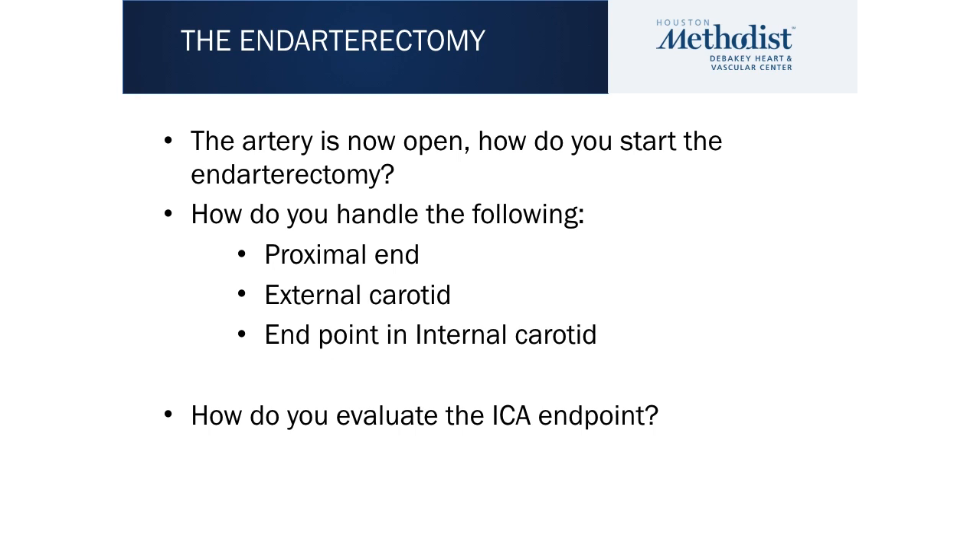The artery is now open. Questions to consider: what is your strategy for starting the endarterectomy? How are you going to handle the proximal end? How are you going to handle the external carotid? How are you going to define the endpoint in the internal carotid artery, and how will you evaluate that internal carotid endpoint?